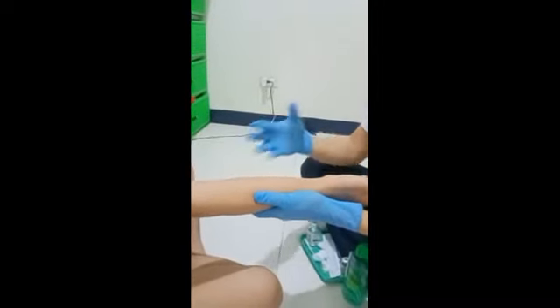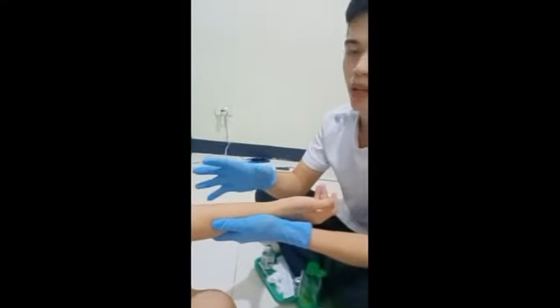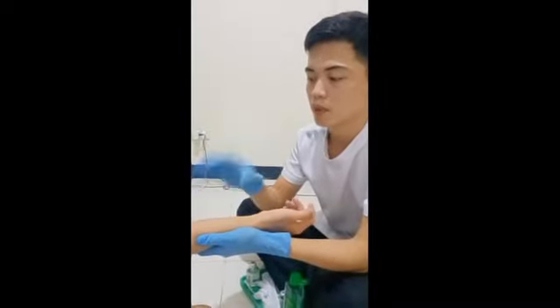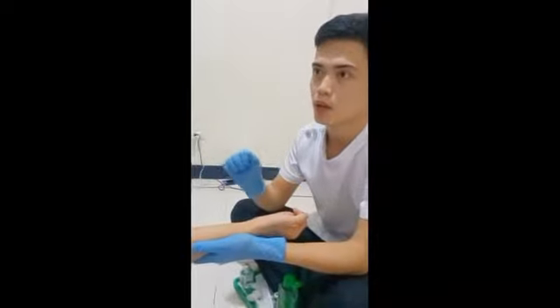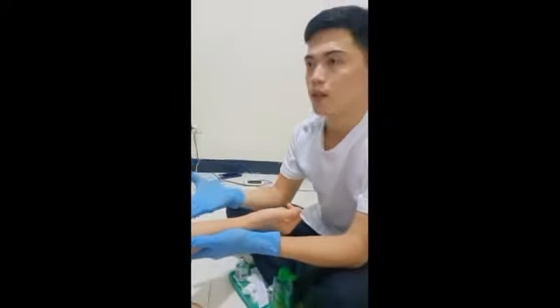So before you do the skin test, you need to check for bleeding and inflammation, because if the patient has an inflammation, you never use the skin test on that skin.